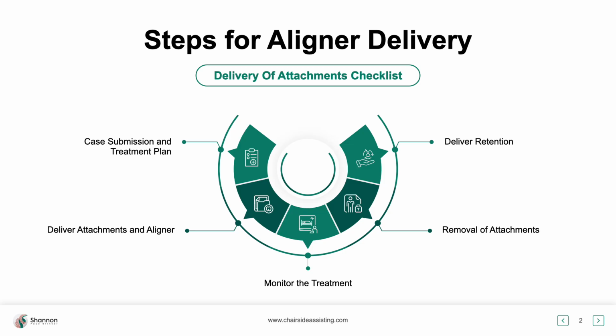This course is really only focused on aligner delivery because most people already know the process. So when we think about that, we think about case submission and the treatment plan. You may or may not have placed attachments before, and that's fine, but you do understand the process. And then also monitoring the treatment, removal of the attachments, and then delivering our retention.